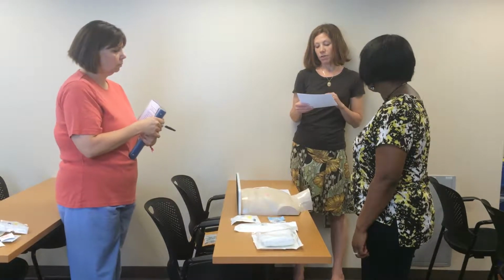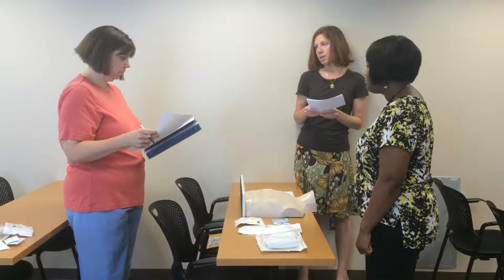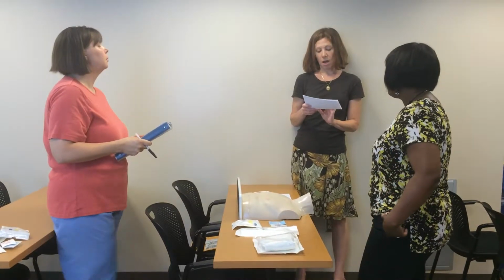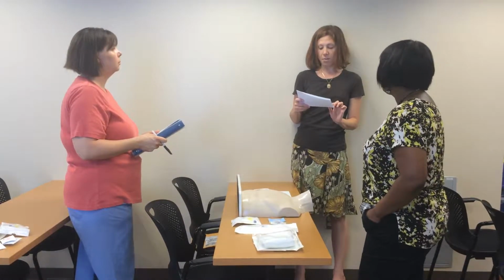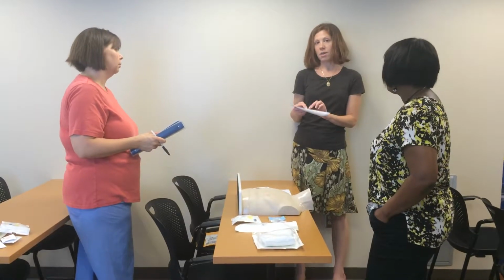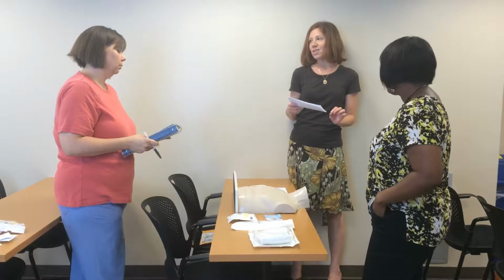Your colleague will have a checkoff sheet that comes from the UNC CVAD policy 0074 and will be observing you to ensure that all of the steps in the procedure of CVAD access and dressing change are done. After both of you have had a chance to do the skill, that is be the preceptor and be the person doing the checkoff, we'll discuss the scenario. While there's no grading for this scenario, I want this to be an opportunity for you to demonstrate both your skills in accessing a central line and your knowledge about caring for neutropenic thrombocytopenic patients in a safe space. Do you have any questions for me before we start?